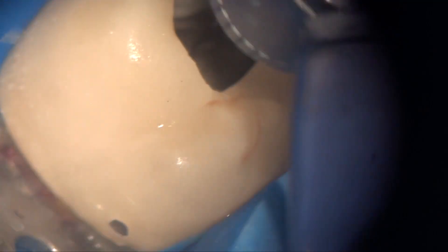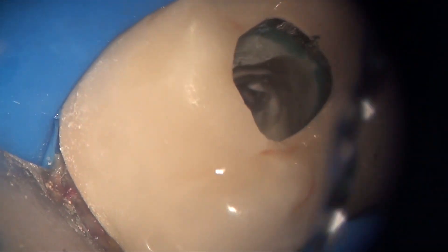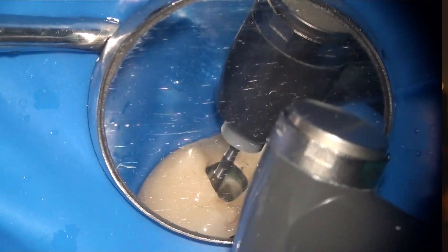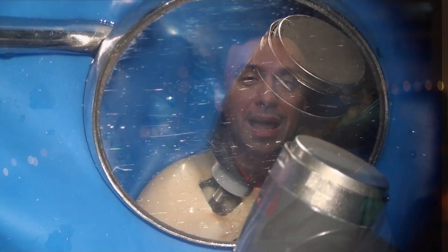I always use ultrasonics and water to flush away the debris after using the orifice opener. Once the mesio-buccal was found, the same sequence of using a file followed by the orifice opener and then the expediter was used in the mesio-buccal canal. The MB2 wasn't located after an initial search and it was decided to spend more time searching for it a little bit later on.